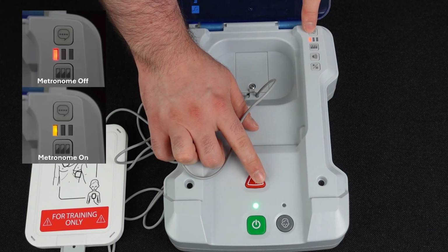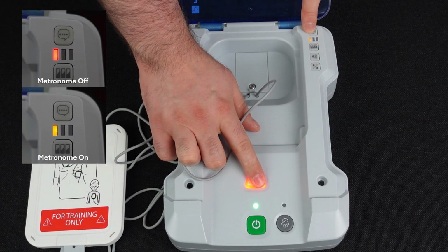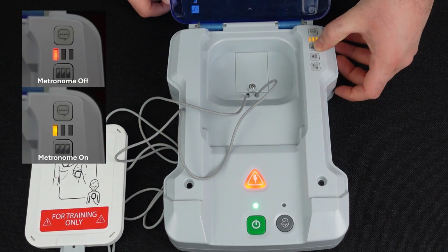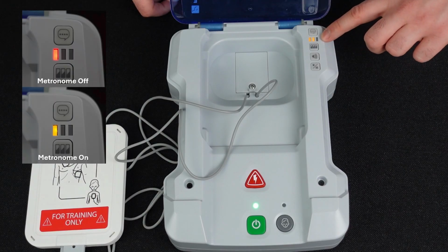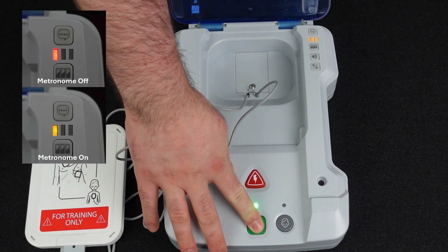When one light is illuminated, you are turning the metronome on or off. Once you have selected the settings you want, click the scenario selection button to check setting choices. Click the power button to save changes and exit the settings.